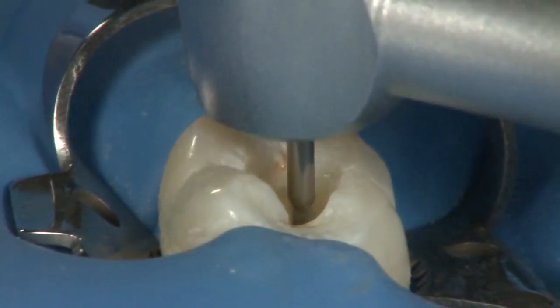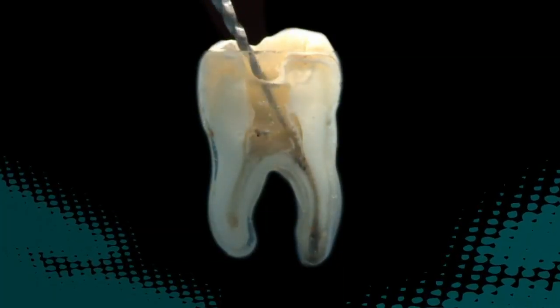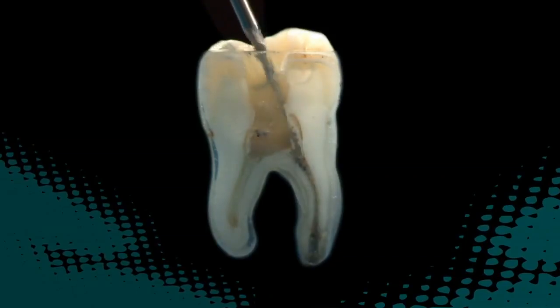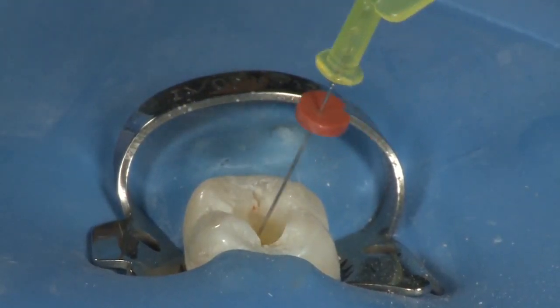It is not necessary to reach full working length with this file. Simply take it to the point of resistance and then stop. This file can also be used in a gentle sweeping lateral motion if greater taper is required. Evacuate the canal and refill with Chloracid.